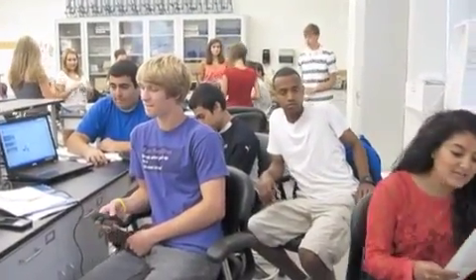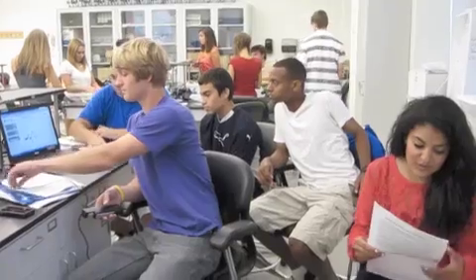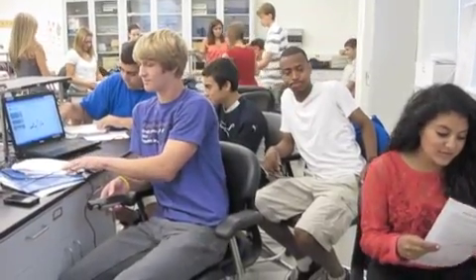Hi, we are from the How to Beat Dr. House at his own game class at Rochester University. Today we will be explaining 2 out of the many labs we have done throughout the week. The name of our lab is Grip Strength Comparison. In our group we have Talosa, Greg, myself, Peter, and Bruce. The materials needed for this lab are a computer, the software, and the grip force sensor.